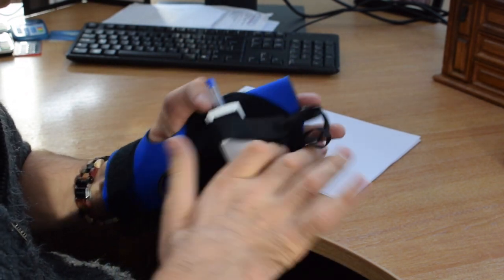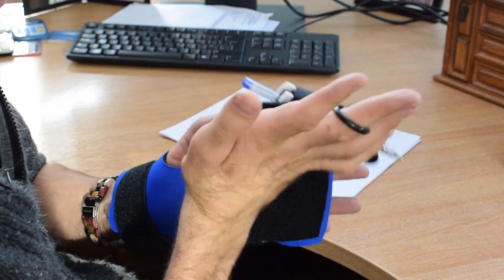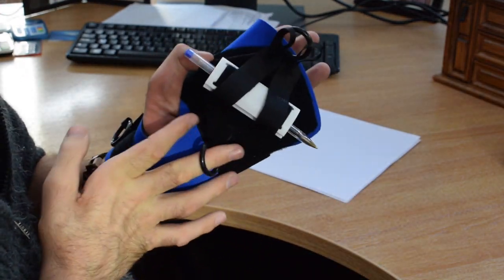Then you can position this at any angle to be able to help you by just putting it on the right way. So I'm going to use it to hold this pen.